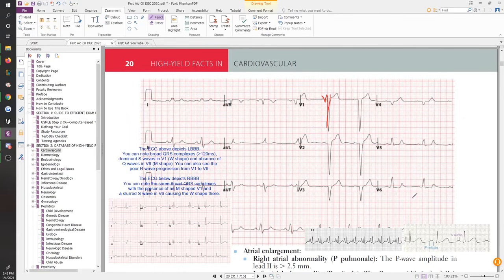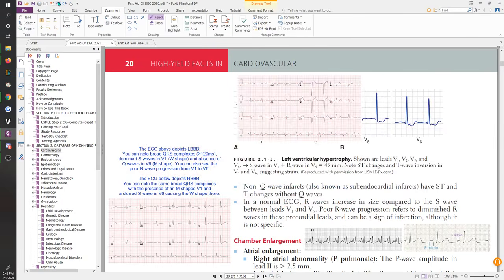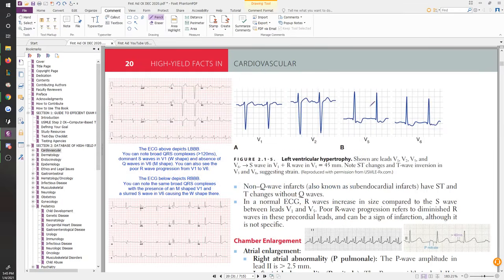And coming back to V6, it's definitely possible that there might be some kind of M activity here that just isn't very visible. But that's what's going to happen on your exam. You're not going to have W's and M's that are extremely clear to catch. There are other things to look for as well, but as far as our bundle branch block stuff we're looking for, it's not going to be that clear. Take a look at this next one as well.